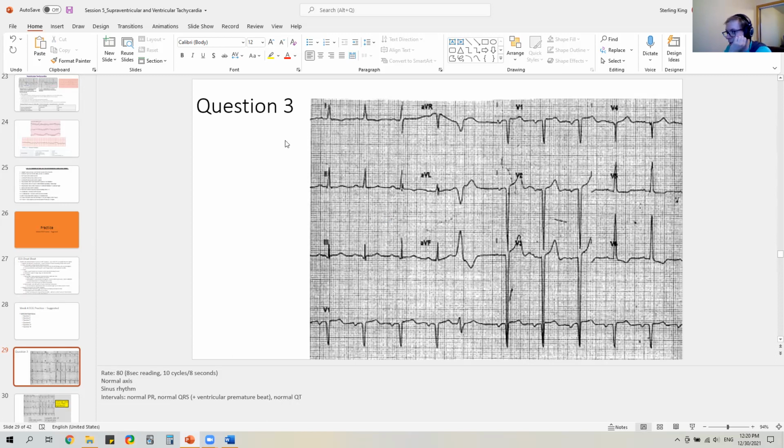All right, so our first sentence is done, looking for hypertrophies. So left atrial enlargement. Yeah, it looks like there's a left atrial enlargement. You can see this is not especially big, but this is inverted and it looks like a decent size. So left atrial enlargement. And then checking for left ventricular hypertrophy, that looks like the case. 1, 2, 3, 4, about 5. And this is definitely enough. Well, about 1, 2, 3, 4, 5. Yeah, it's well over enough. So left ventricular hypertrophy, and right ventricular, no, because we have S waves to R waves.